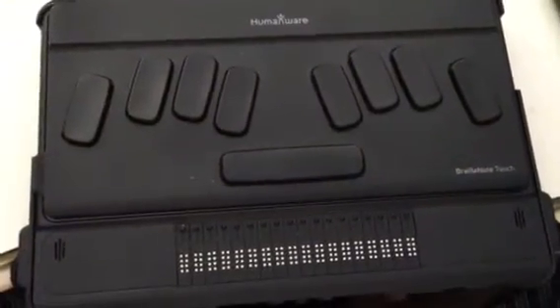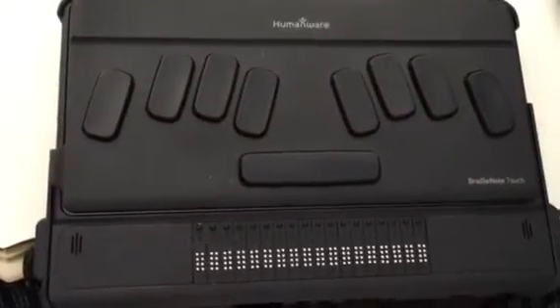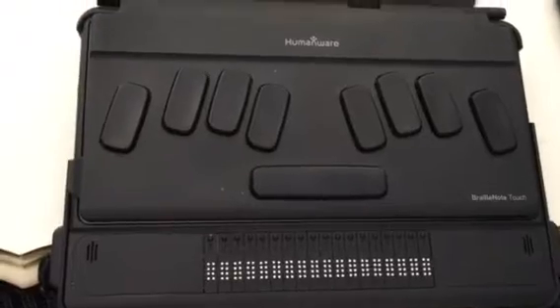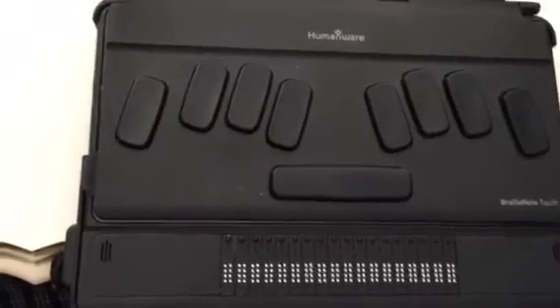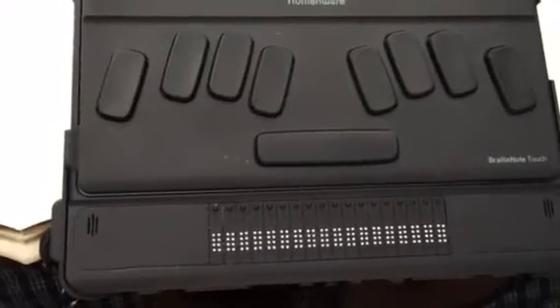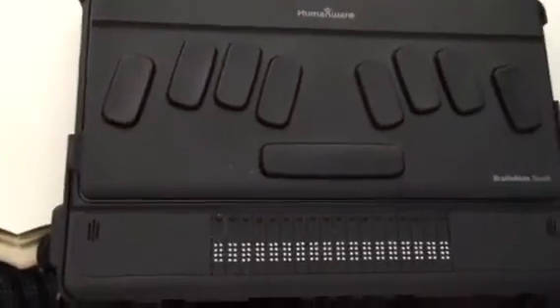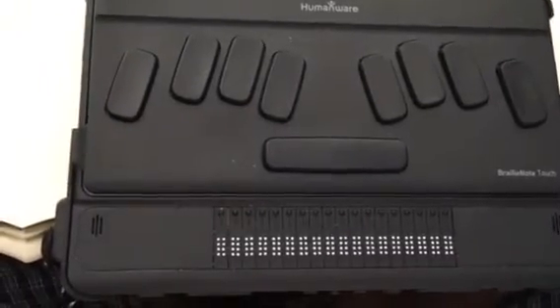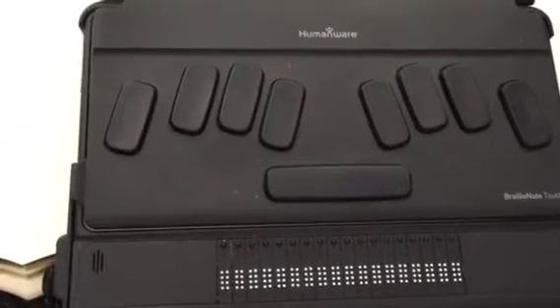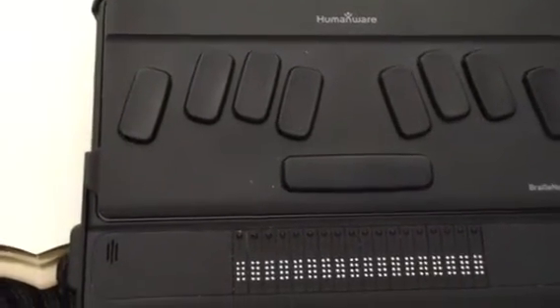Hey YouTube, Gallagher123123 back with you again with another BrailleNote Touch tutorial. This time around we're going to be looking at how you can lock and unlock the BrailleNote Touch. Since this is a tablet, you no longer have the rocker switch design that was common on BrailleNotes prior to the Touch. So instead you have more of a traditional tablet style of locking and unlocking and powering off.